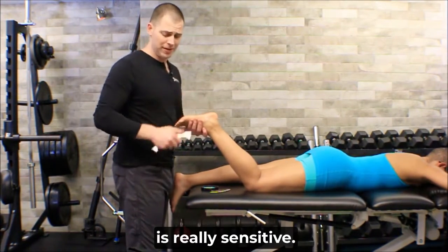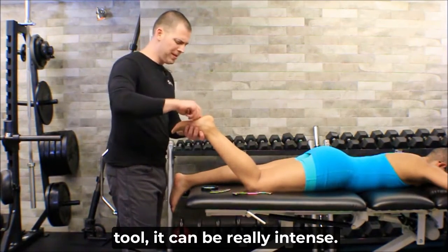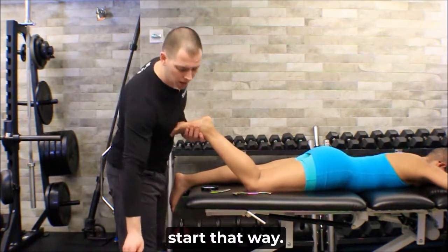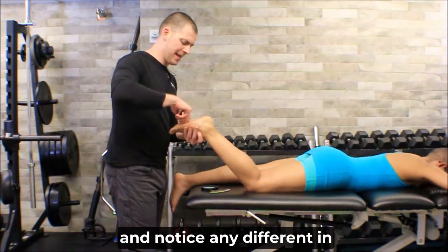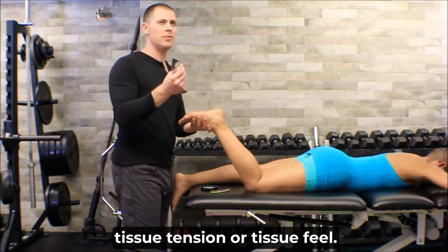The bottom of the foot's really sensitive. If I were to use this scanning tool, it can be really intense. Maybe I don't want to start that way. All right, so I'm going to scan and notice any difference in tissue tension or tissue feel, right?